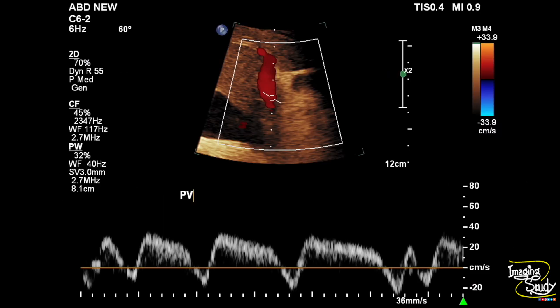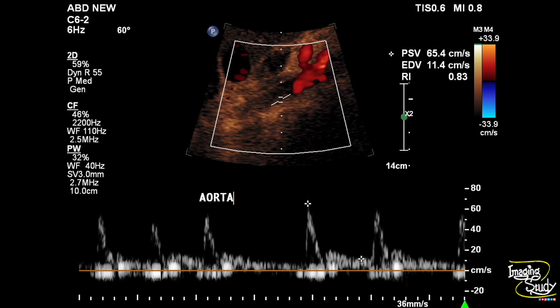Here is another picture showing the abnormal wave pattern of the portal vein. Here is the spectrum from the proximal part of the abdominal aorta, and there are some irregular beats due to congestive cardiac failure.